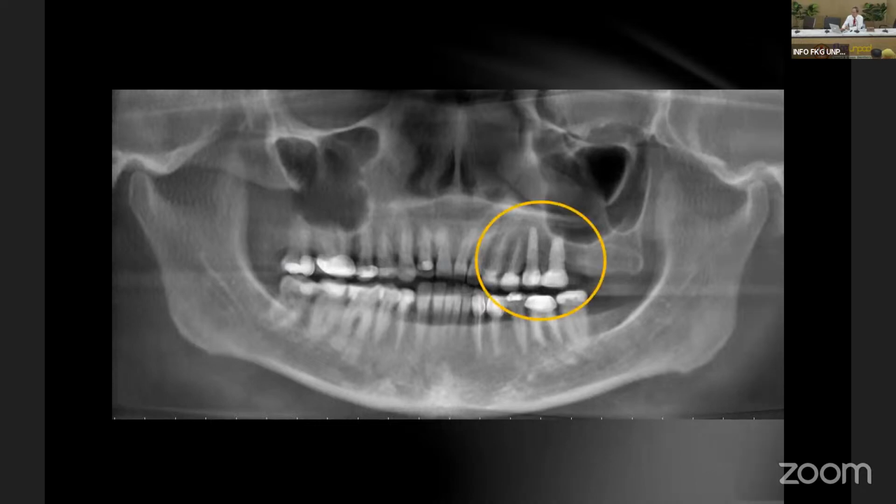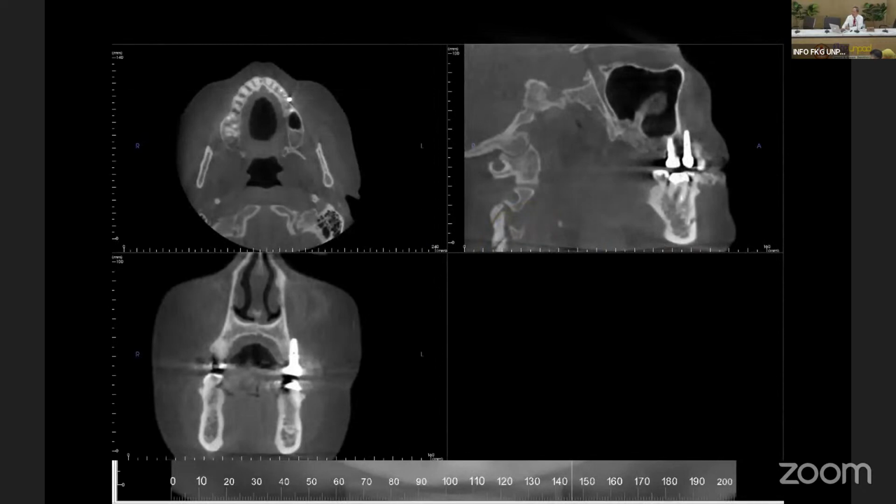But when we take a cone beam, we see that there's a buccal perforation of the implant. That's the reason for the patient's discomfort after implant placement.